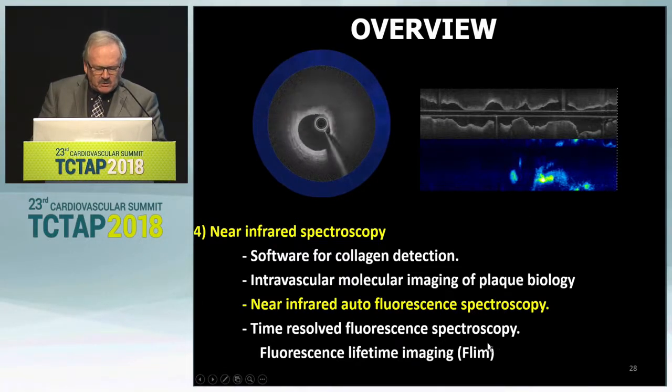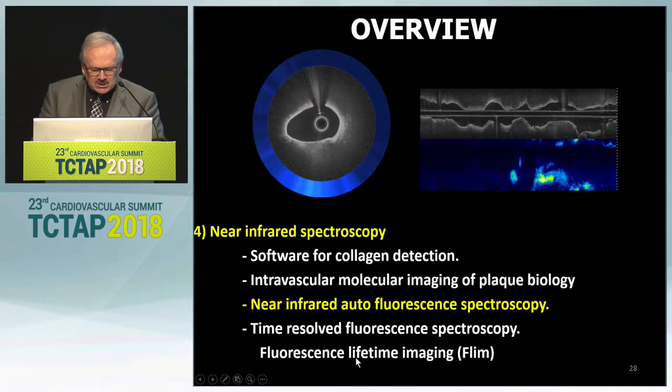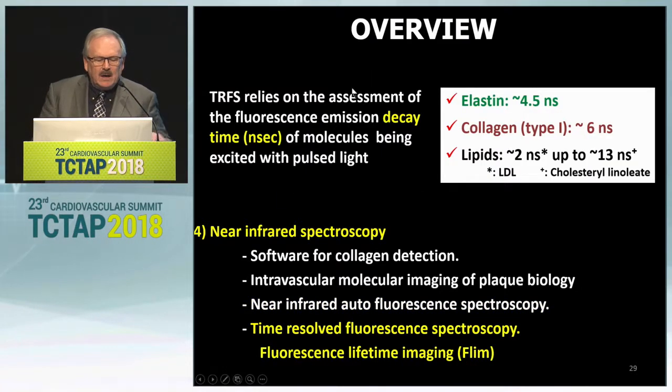And then the top of the top is what we call time-resolved fluorescence spectroscopy, fluorescence lifetime imaging, FLIM, as they call it. Just in a word, it's a technique which relies on the assessment of the fluorescence emission decay time, in nanoseconds, of molecules being excited with pulsed light.